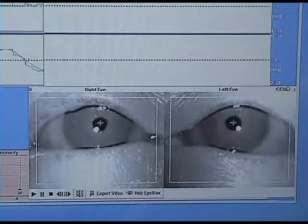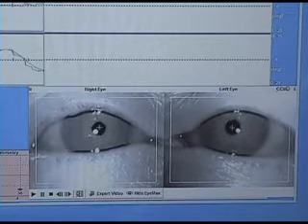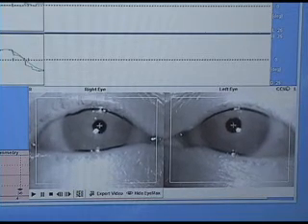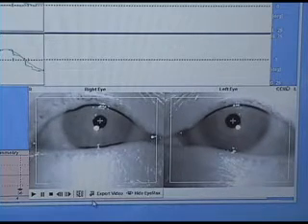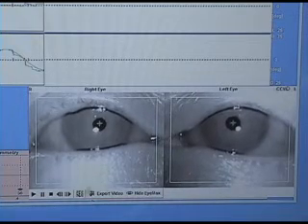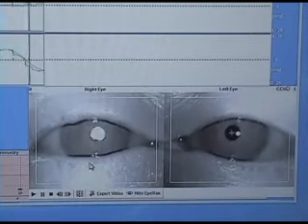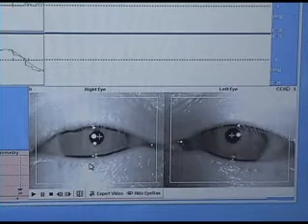So here are these eyes going up and down, but you see his eyes, as they go up and down, are also going side to side, which is the horizontal movement. He should not have any horizontal movements while he's doing vertical movements, because the ball is only going up and down, it's not going side to side. So this guy has problems with stability in the horizontal plane as he's going up and down.